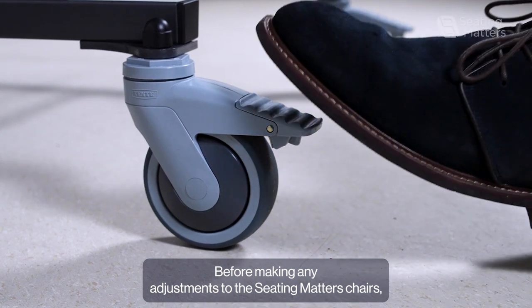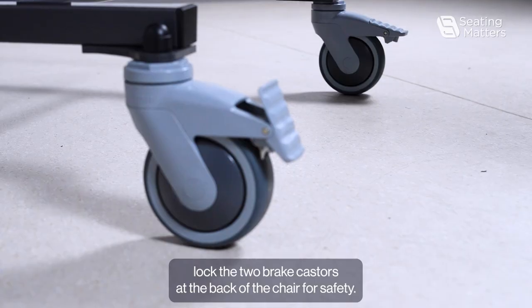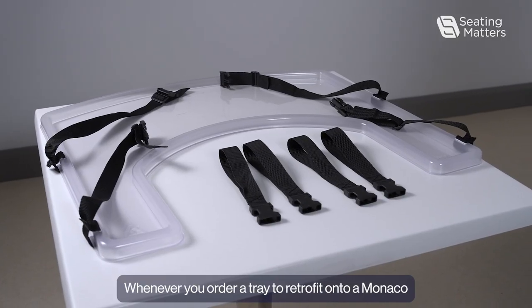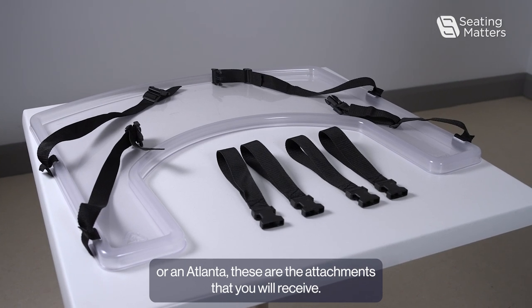Before making any adjustments to the Seating Matters chairs, lock the two brake casters at the back of the chair for safety. Whenever you order a tray to retrofit onto a Monaco or an Atlanta, these are the attachments that you will receive.